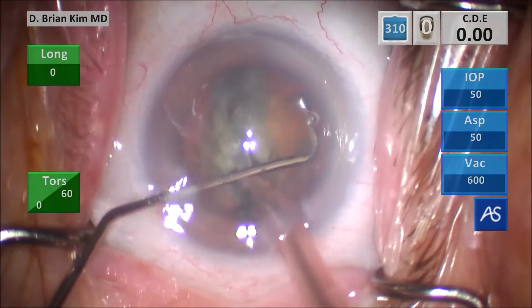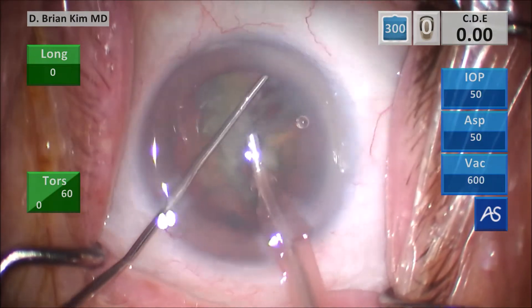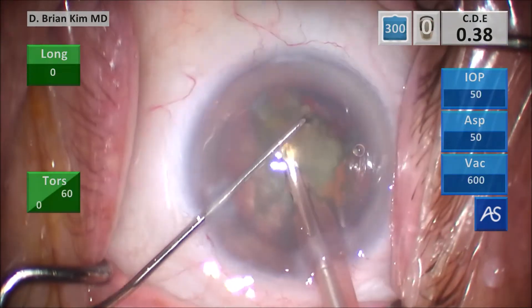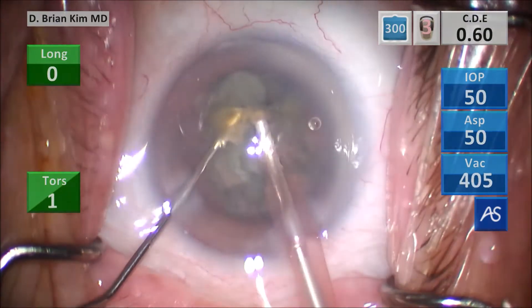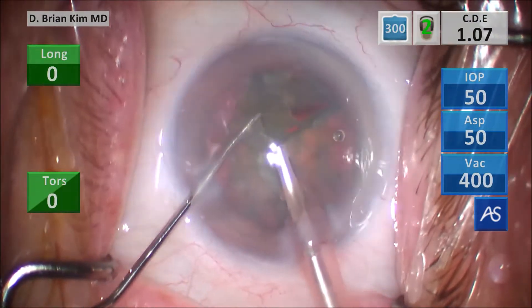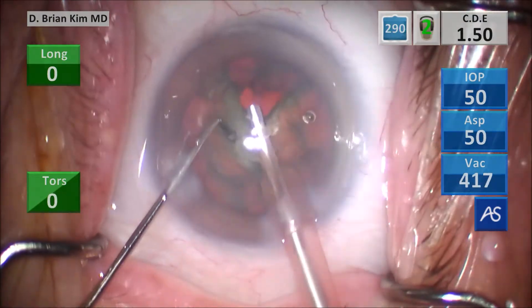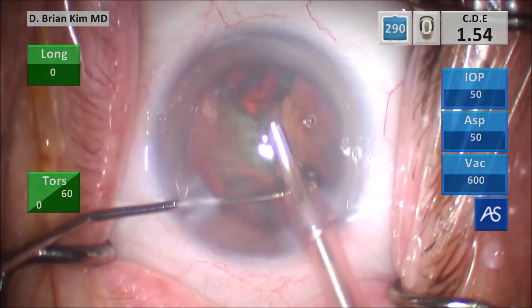That's double-chop — placing the chopper on the right-hand nucleus, sudden loss of resistance, fracturing that right-hand nucleus in half, lifting that first quadrant up with a little vacuum, getting the chopper around it, crushing the lens between the instruments into smaller and smaller pieces. When you're using double-chop and cross-chop, even though I'm working inside a hole, this is not a limitation to lens disassembly when using mechanical fracturing forces — double-chop and cross-chop to disassemble the lens.